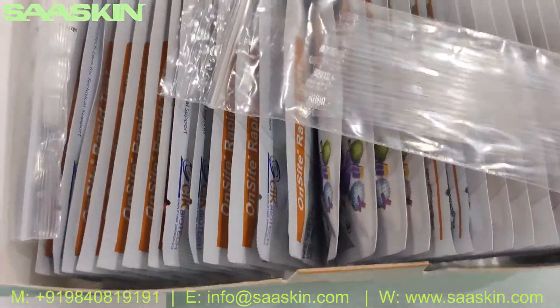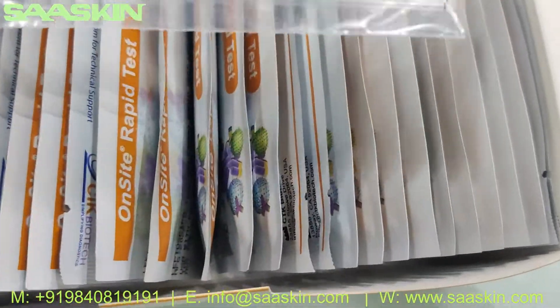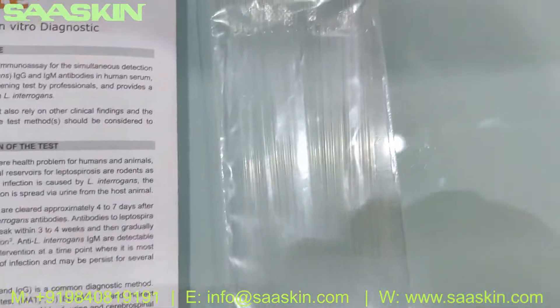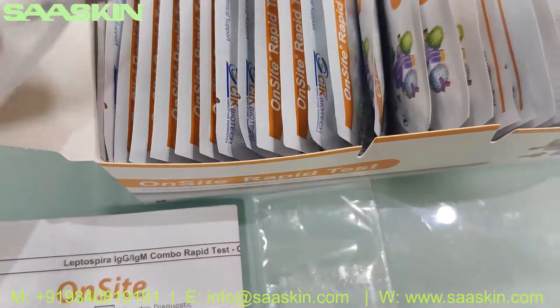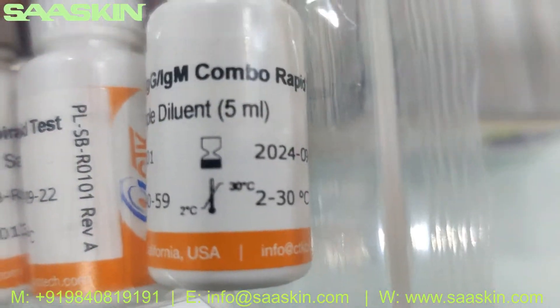So let's go inside the box. You get 25 capillary tubes — actually, you get 3 buffer bottles. Each one is 5 ml.